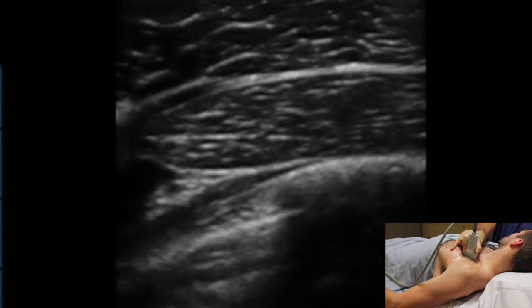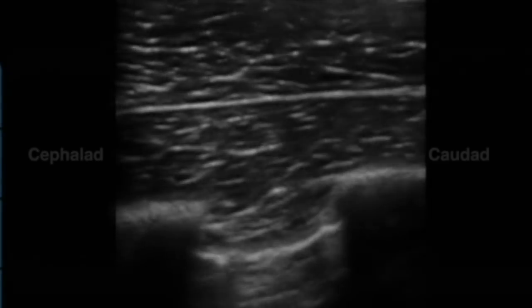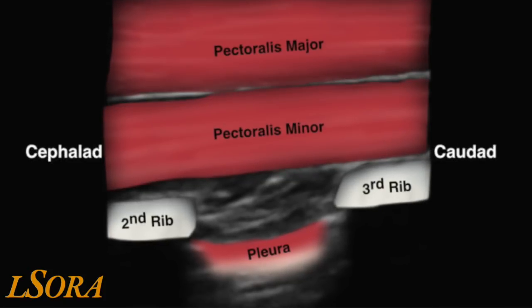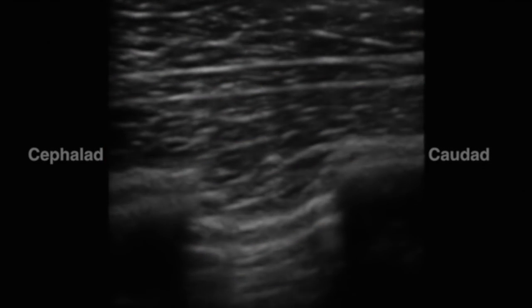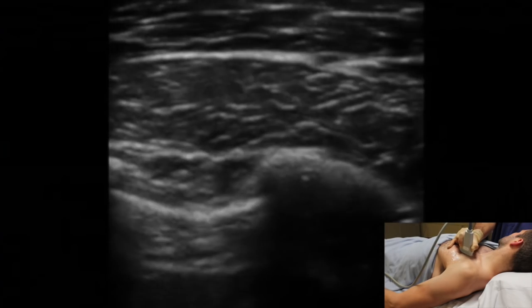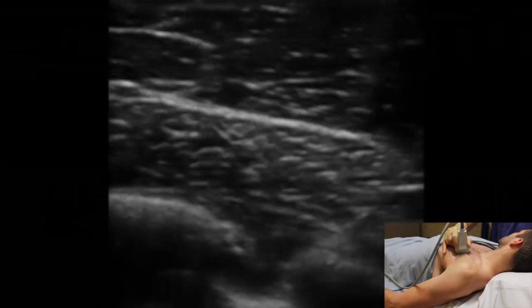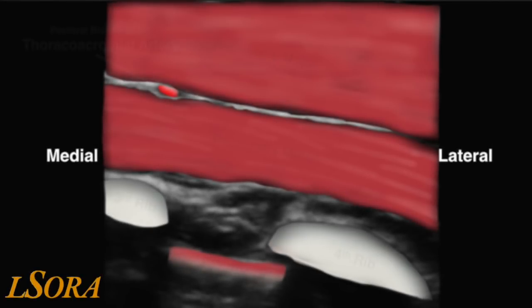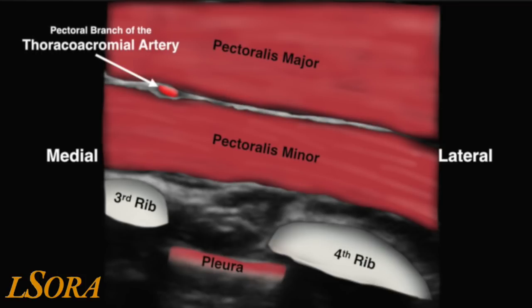From this initial scan position, the probe is slid down the patient's chest in a caudad direction, counting the ribs as you go. In this schematic, you can see pec major and pec minor, the interfascial plane between them, and the second and the third rib. Once the third rib is identified, the probe is rotated through 90 degrees and slid towards the lateral aspect of the chest wall. Once you've reached the lateral aspect of the pectoralis minor muscle, the image generated allows you to identify pec major, pec minor, one of the pectoral branches of the thoracoacromial artery between the two of them, and the third and fourth rib.